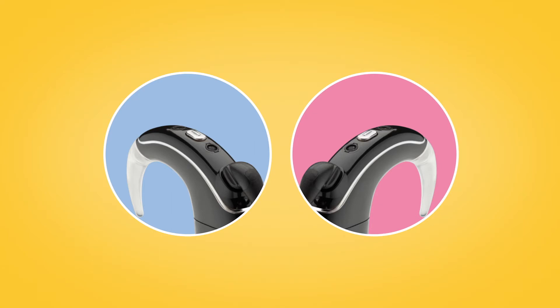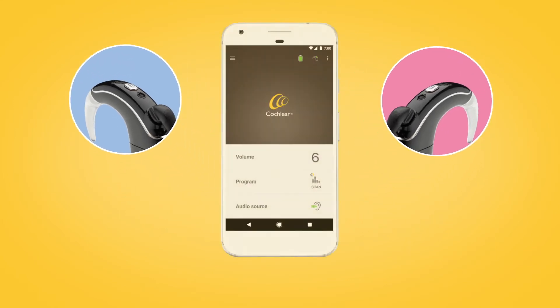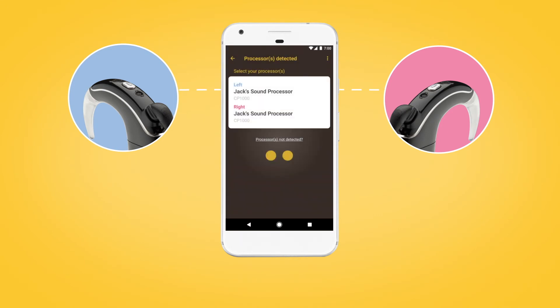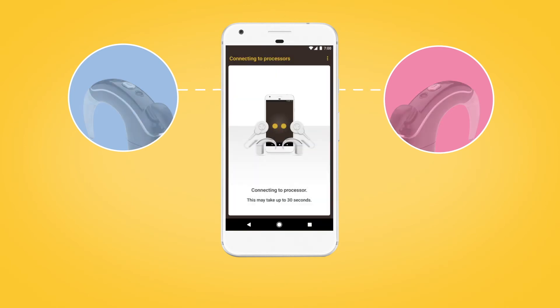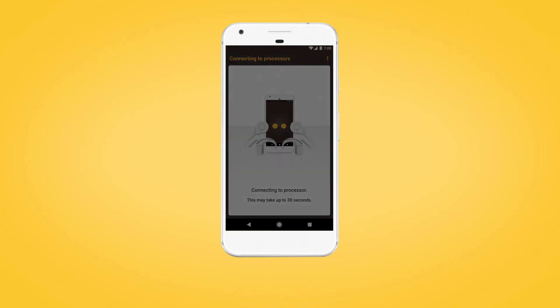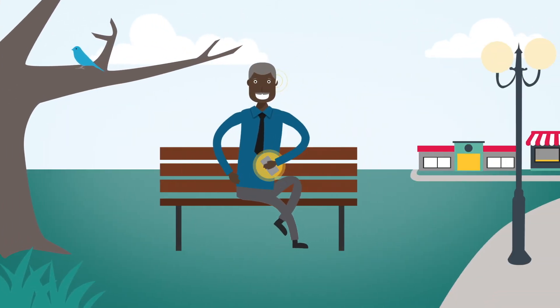If you have two sound processors, both need to be paired during the same pairing window. To do this, turn each of your sound processors off and back on again. Your compatible Android device will search for your sound processors and display them as a pair in the Processors Detected screen. Select your processors and tap once to begin pairing them. You will need to verify each processor individually. Follow the screen prompts to complete verification and pairing for both processors as previously described.